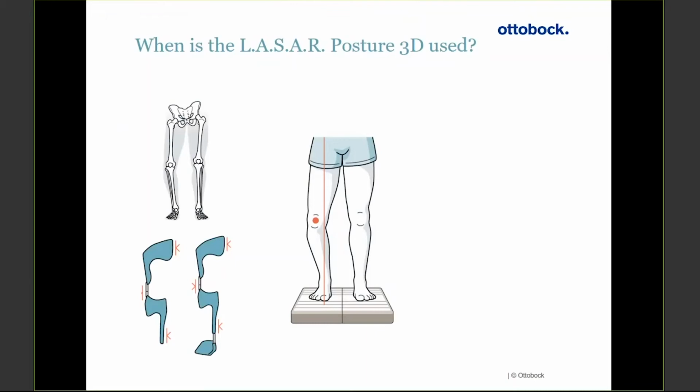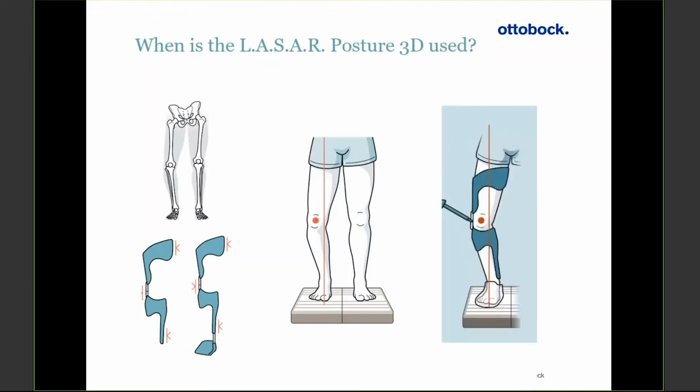And then when we're applying this orthotic, the thing is, for orthotics you don't really have an onboard documentation like you do in prosthetics. So it's nice to know where the optimal alignment is. You can't necessarily achieve it, but with 3-point pressure systems, you can see how close you are. Yeah, exactly.